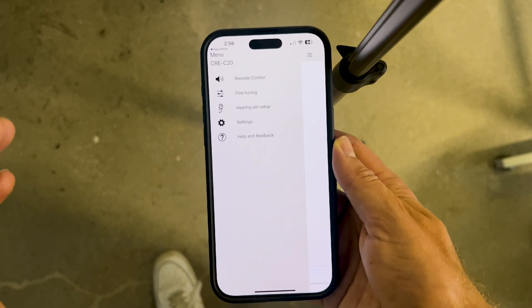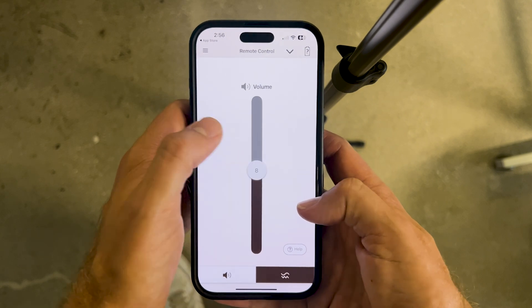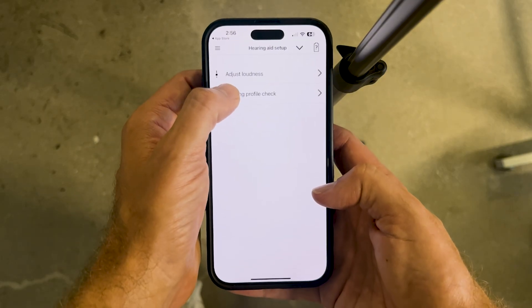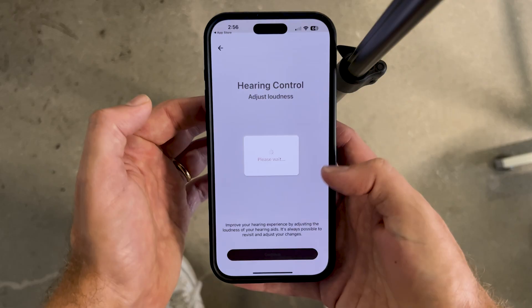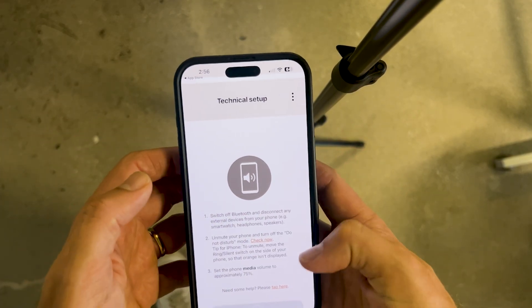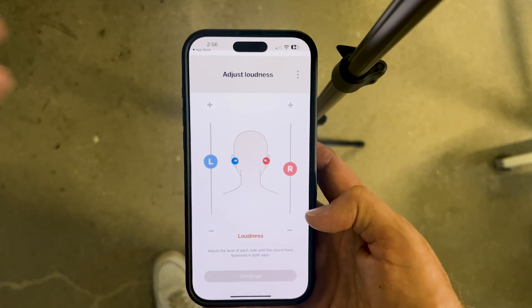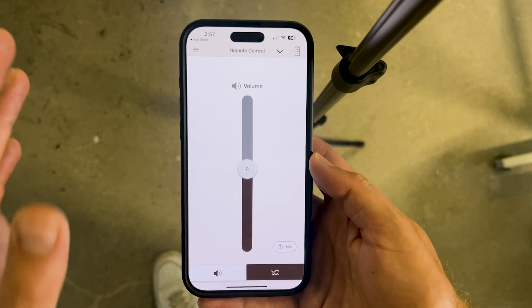Another thing we hear from folks is that they want to alter the master volume — not just the slider, but make everything louder or quieter overall. You can head back into hearing aid setup and instead of going into hearing profile check, go into adjust loudness. This gives you the opportunity to manually change the volume in your right and left hearing aids independently. It's also a way to change the sound balance: if you feel like your left or right ear needs a little boost, you can turn that up and it will apply to your master settings.